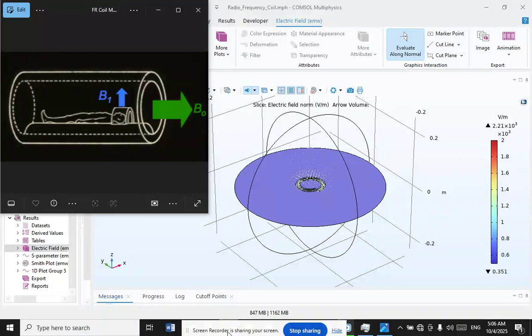Advances in MRI hardware such as increased field strength and improved gradient performance have been substantial. Advances in radiofrequency technology have also proved valuable to improve the resolution and shorten the duration of MRI examinations. MRI RF coils are essential components for every MRI examination as they are responsible for the excitation and reception of the MRI signal.